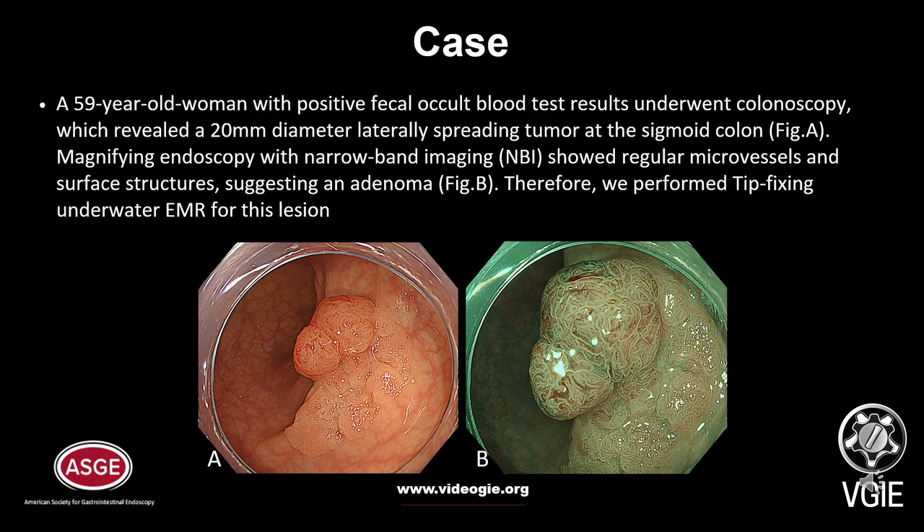A 59-year-old woman with positive fecal occult blood test results underwent colonoscopy, which revealed a 20mm diameter laterally spreading tumor at the sigmoid colon. Magnified endoscopy with narrowband imaging showed regular microvessels and surface structures suggesting an adenoma. Therefore, we performed tip-fixing underwater EMR for this lesion.